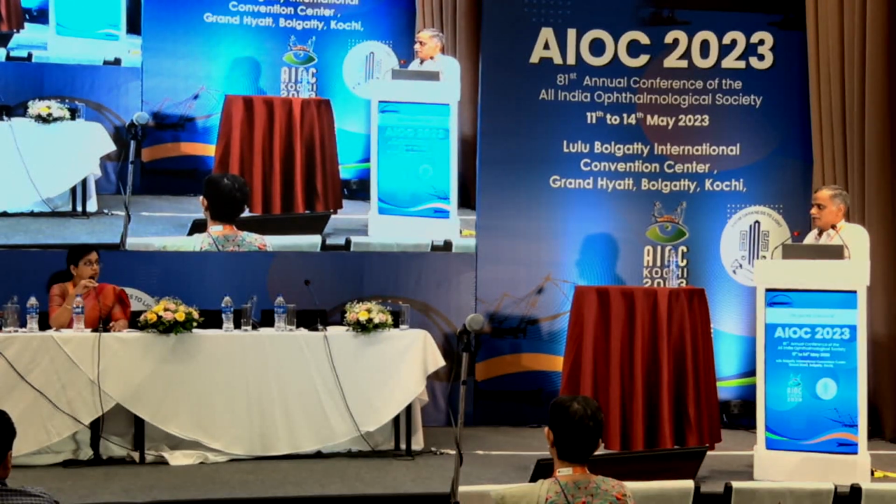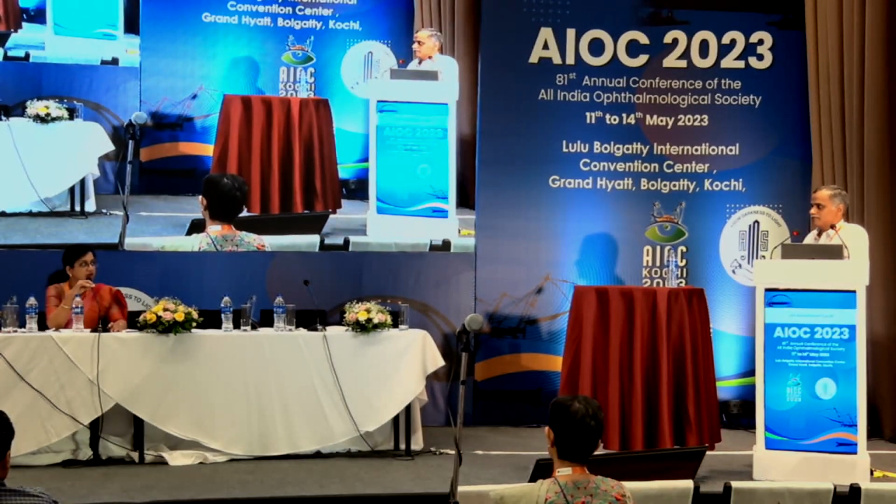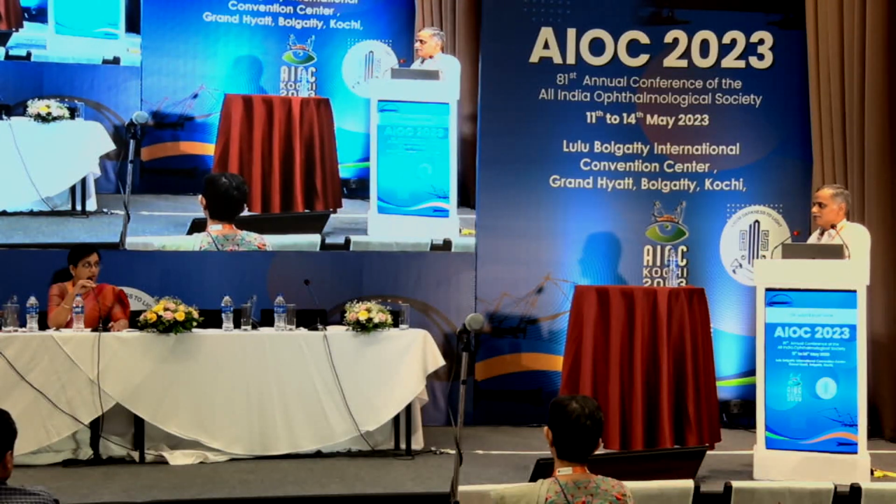Yes. So neuroretinal rim changes and nerve fiber layer defects, I think, are quite hallmarks. And disc hemorrhage, needless to say, is very specific; in the setting of other changes, it is glaucomatous damage.